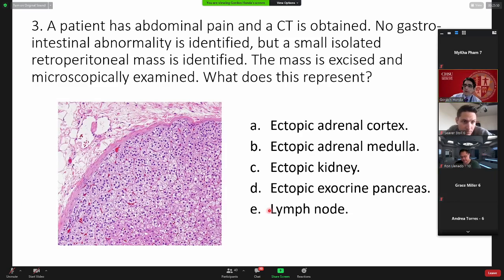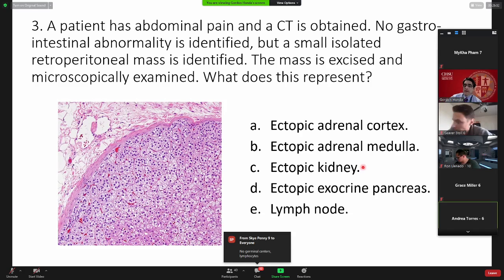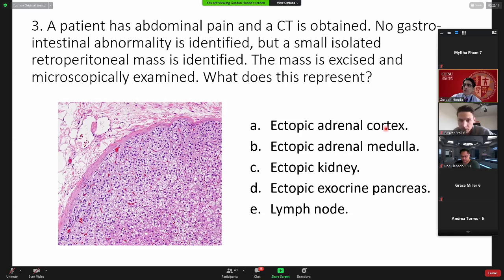Well, that's the start. Okay, so let's keep on with group 6. Could it be ectopic kidney? I was thinking that because there's a change of tissue and maybe a little bit of an adipocyte, perhaps. It was more of an adrenal cortex sample. Okay, so you're jumping to adrenal cortex. That's fine. But actually, I'm trying to ask a more pointed question, like, could it be kidney? Let me just toy with you. So someone else in group 6, let's say I met you on the street and said, I'll give you $50 if you tell me this is a kidney, and you can tell me why.